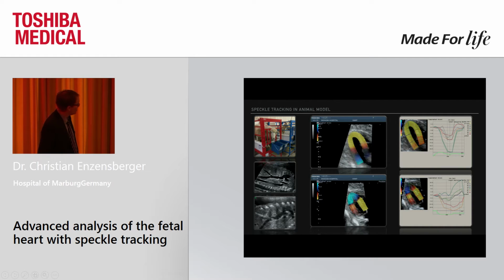This is one of our cases we did in Melbourne in an animal model where in a sheep fetus an occluder was placed in the foramen ovale, and we did our analysis before and after the intervention. When you see, I'm sorry, the laser pointer is not working.